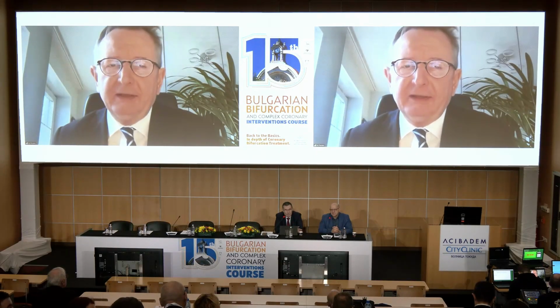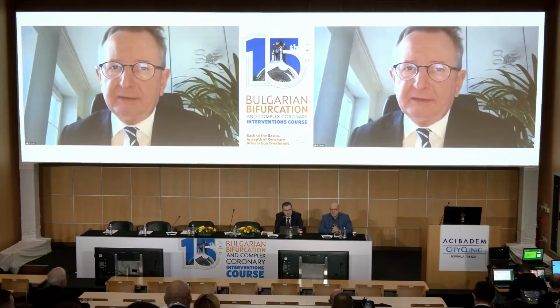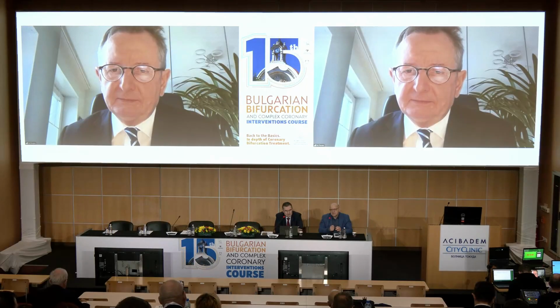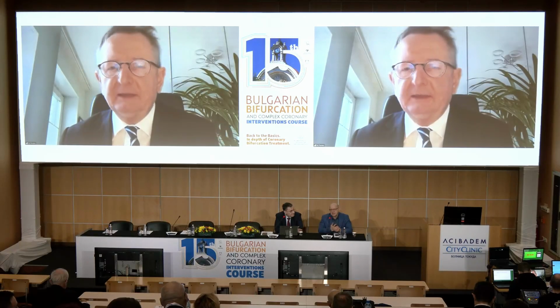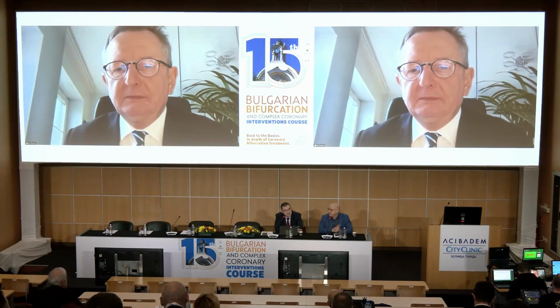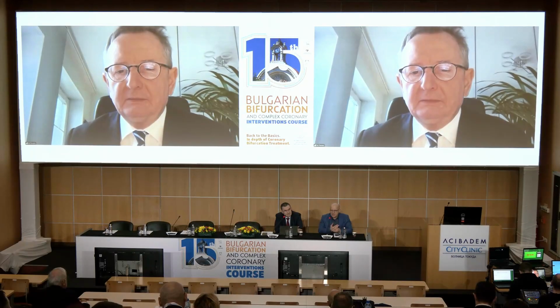You reduce the length of each push, although usually 15 seconds is recommended. That's an important tip and trick: short time, a lot of repetitions.